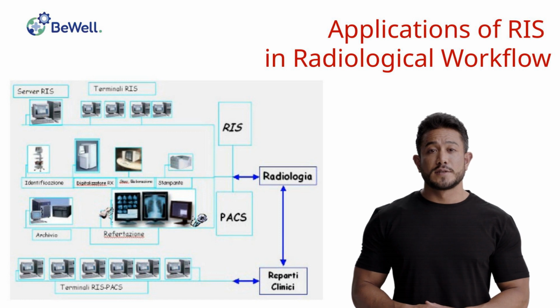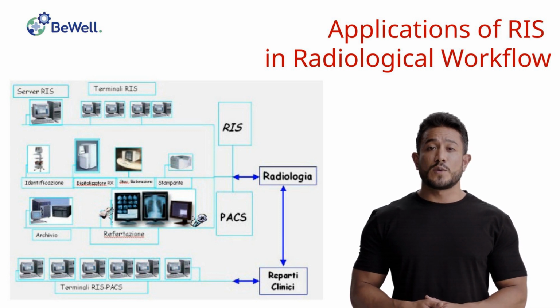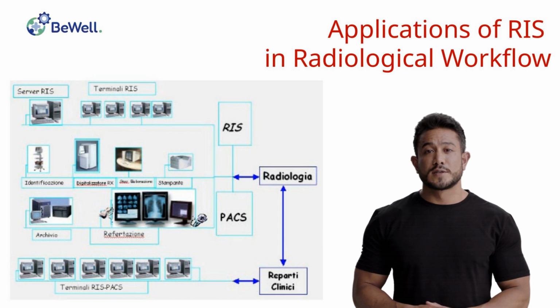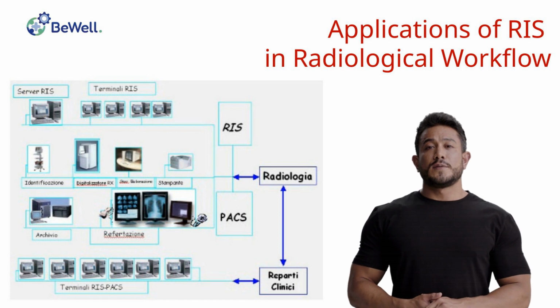After these operations, the RIS schedules an appointment and generates an informational sheet, which is handed to the patient or sent to the department, providing the necessary preparation instructions for the specific examinations.